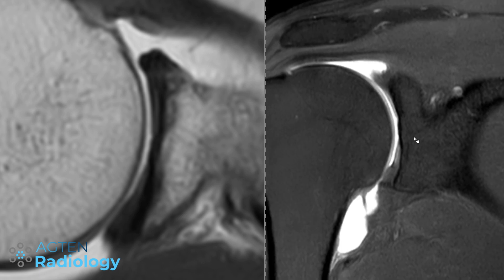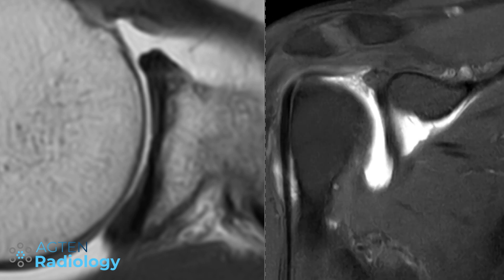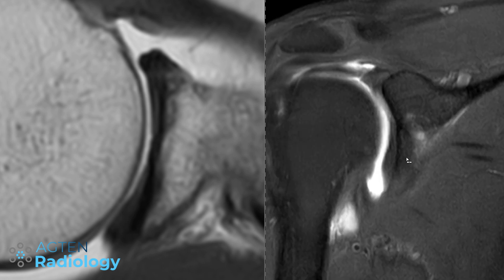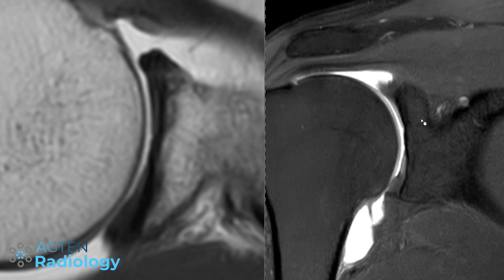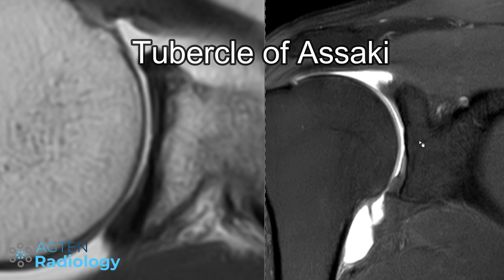So what's that? Is that an osteochondral lesion? Is it cartilage wear, a cartilage defect, or is it just a variant? And you probably guessed it by now — it's just an anatomic variant and this is called the tubercle of Asaki, or Asaki's tubercle.